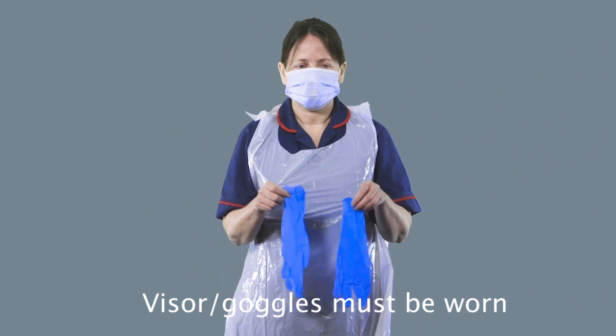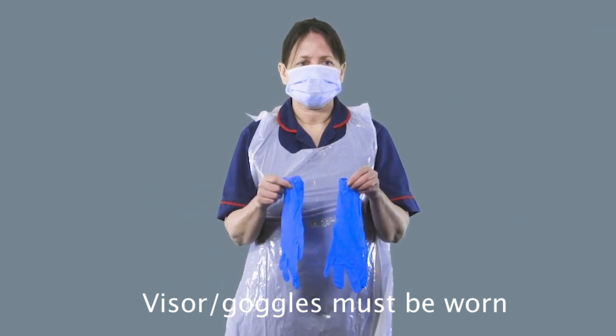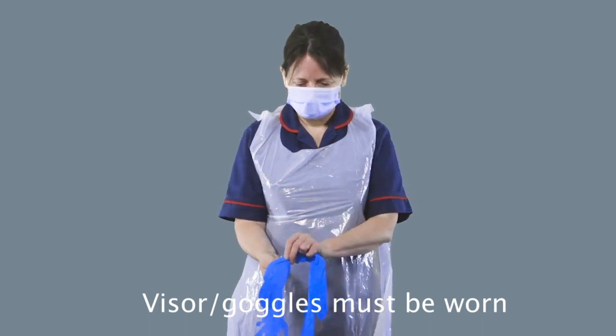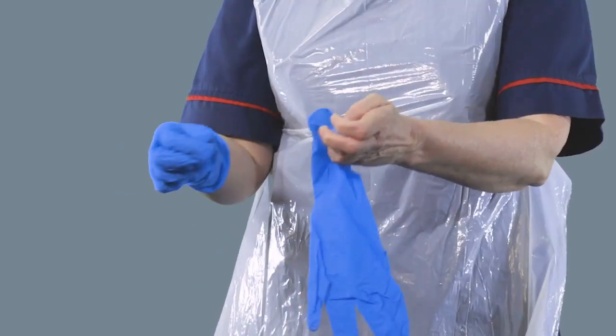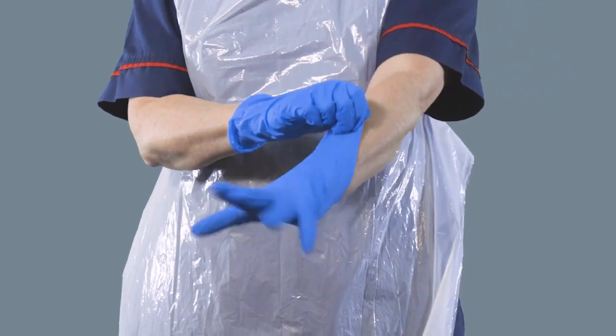Finally, you're going to put on your gloves. With your gloves, try not to handle the outside of the glove, working your thumb and your fingers on each hand and extending up your wrist for full protection.